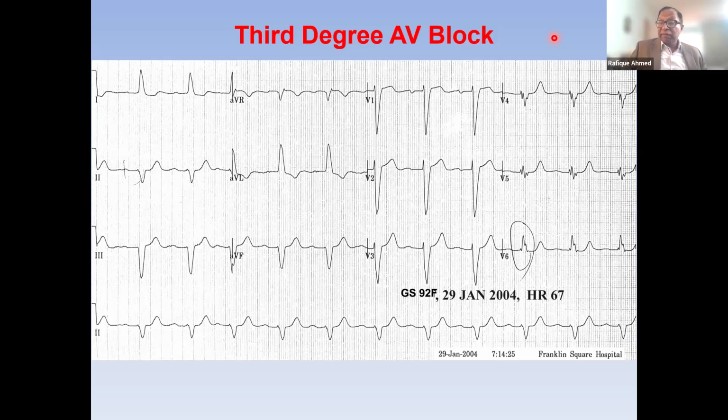Okay. Dizziness is such a vague symptom that I never promise anybody anything. It can be from many, many causes. If this patient came with syncope and bundle branch block, that's a different story. So what we do, let's say somebody has bundle branch block, left bundle or right bundle, depending on the suspicion.